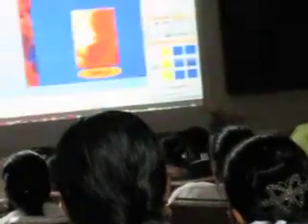But still, we continued to scan, and now she is around 20 weeks. Now it has grown well. So it's not that much alarming. It only means those patients need to be watched a little more closely. And once you reach the 20-week scan and you have done a detailed anatomy scan, nothing is wrong, the growth is all right, forget about what happened the first time. After that, you don't need to worry, because if a fetus crosses the first trimester, the chances it will miscarry are very low.